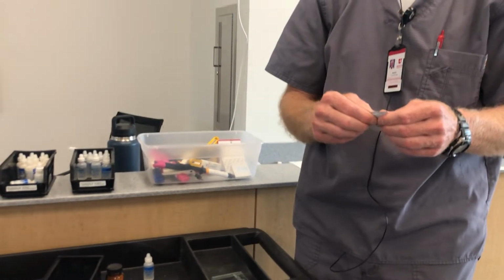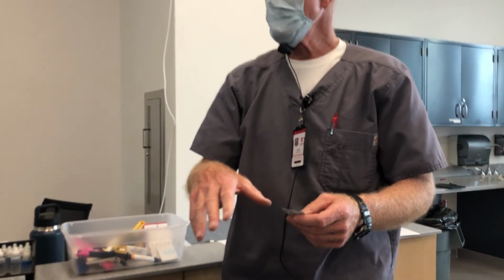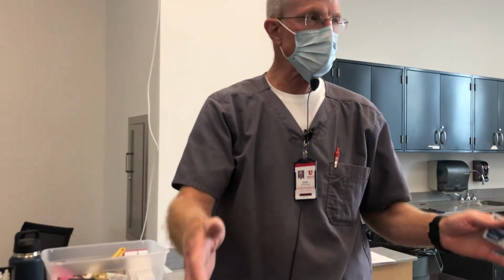Now, eugenol can interfere with your bond strength if you're bonding something. You've got to be aware of that. It's most critical within the first week. A temporary that's been on more than a week, usually the eugenol is not going to be a problem with the bond strength. But if you have a temporary that's just on for a day or two with eugenol in it, and then you go to bond after, you may have some degradation of the bond strength.